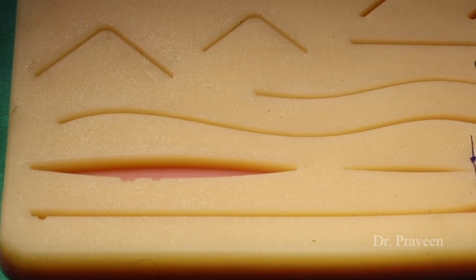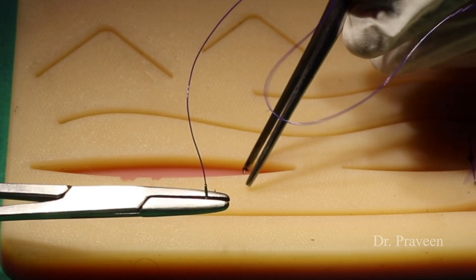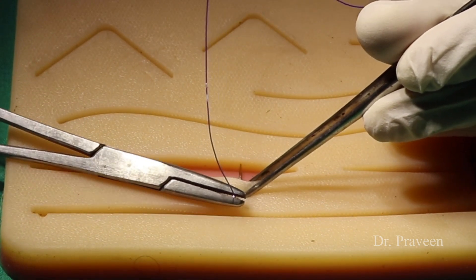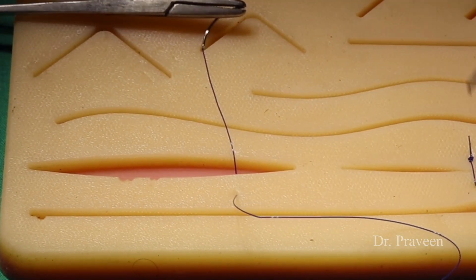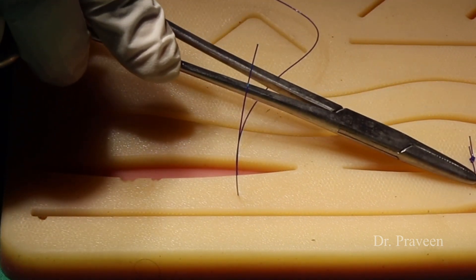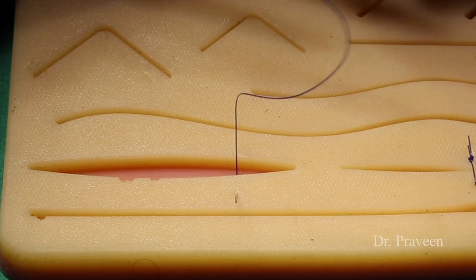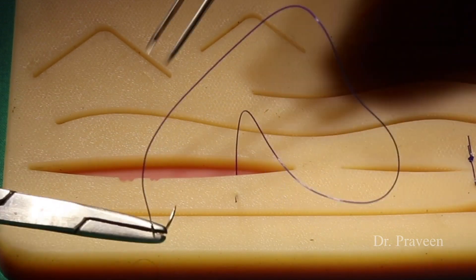The next one is Gofanika suturing — resembling a gulail or the foot of a dove. This method is used when there is gaping of the wound and can be compared with the blanket suture, horizontal mattress suturing, or vertical mattress suturing. The advantage of this method is its use in tension sutures or re-suturing; the disadvantage is that it is cosmetically less accepted.